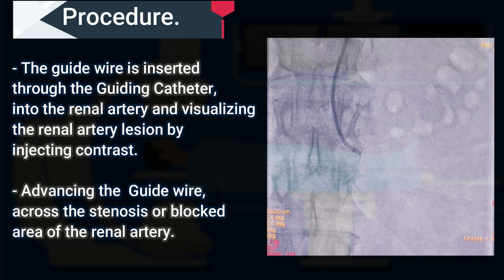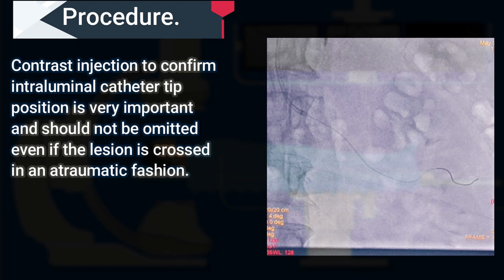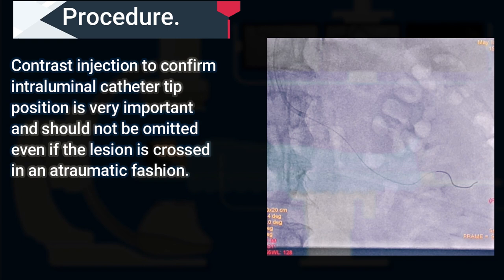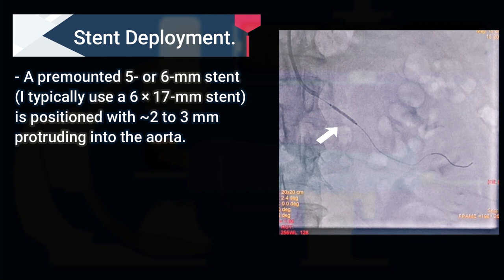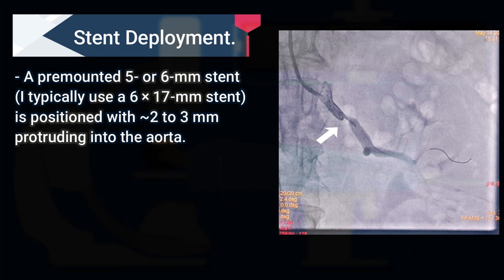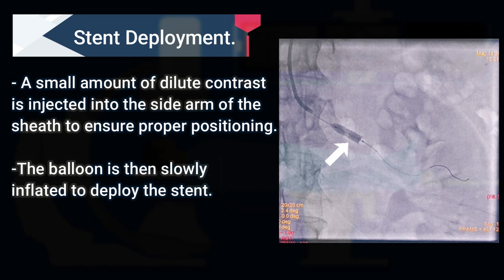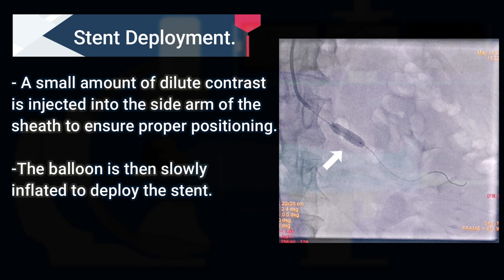Contrast is injected to confirm intraluminal catheter tip position. This is very important and should not be omitted even if the lesion is crossed in an atraumatic fashion. After crossing the lesion, the pre-mounted 5 mm or 6 mm stent is positioned with 2 to 3 mm protruding into the aorta. After positioning the stent, a small amount of diluted contrast is injected into the guiding catheter to ensure proper positioning.